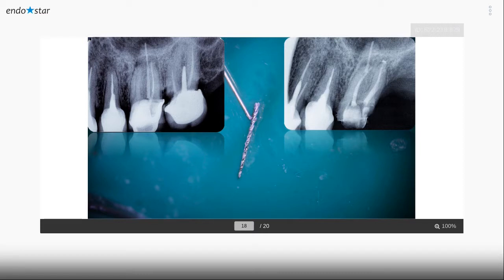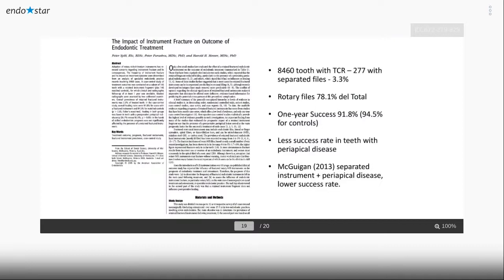If we are at risk of removing that coronal dentin that is very important for the long-term success of the tooth, it's better to decide just to leave the file and observe, because having the patient in regular controls is another way of taking care of a broken instrument, and then analyze all the possibilities that we might have to accomplish a good result in our treatments.